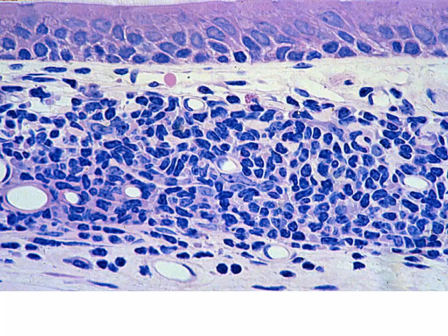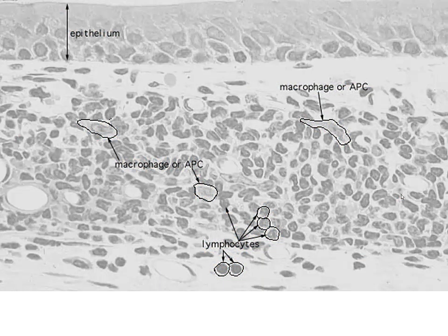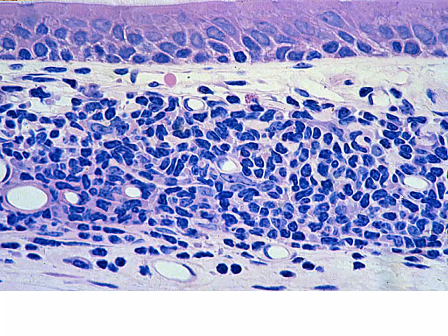We have a lot of these in our digestive tract. Much of what you're seeing in here is going to be lymphocyte tissue. You'll have fibroblasts as well, but this is just a whole conglomeration, mostly of lymphocytes, plasma cells. You see there, they're labeling some of the macrophages. Those are so challenging to point out.